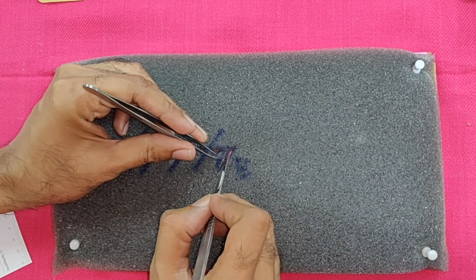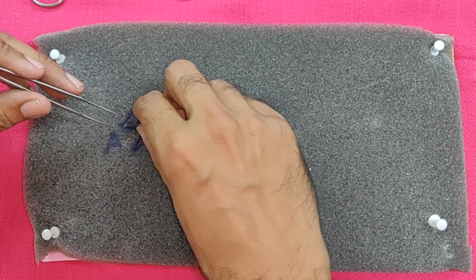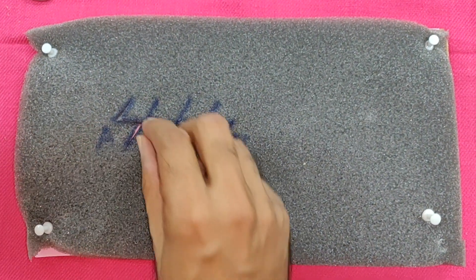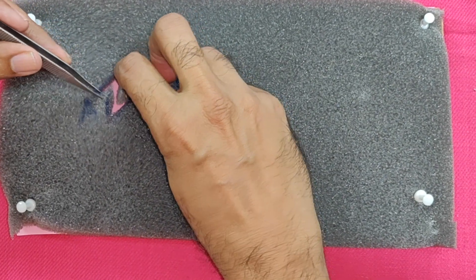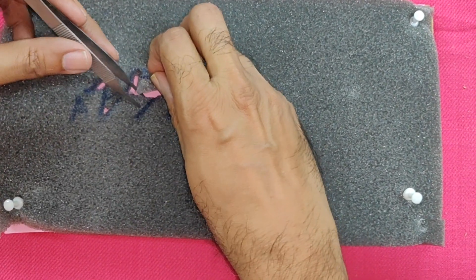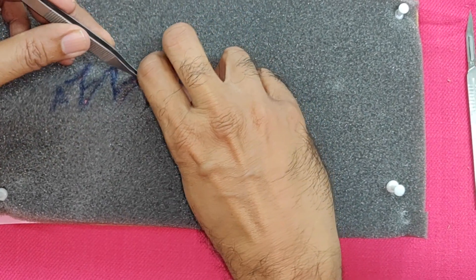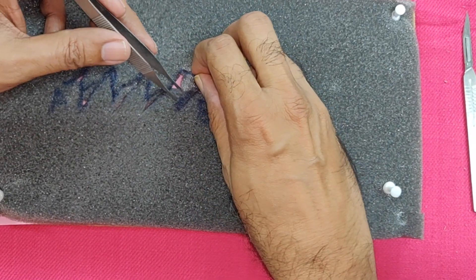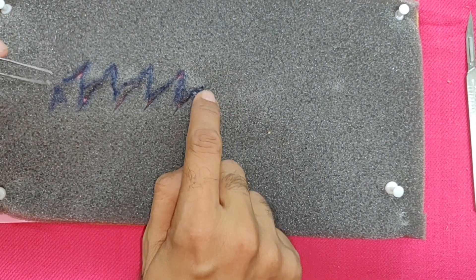Now that the flaps have been incised, you need to transpose them. I will show it with my fingers because the tissue is very soft. It transposes like this — these two flaps transpose, these two flaps are going to transpose here, and these two flaps are going to transpose into this. So now you have a lengthening of the band.